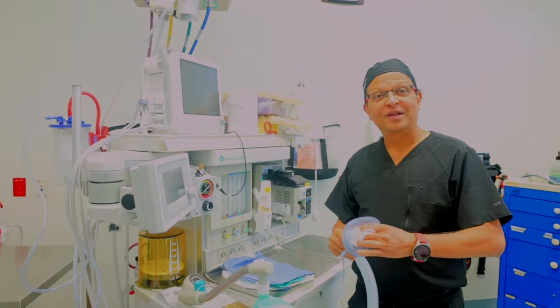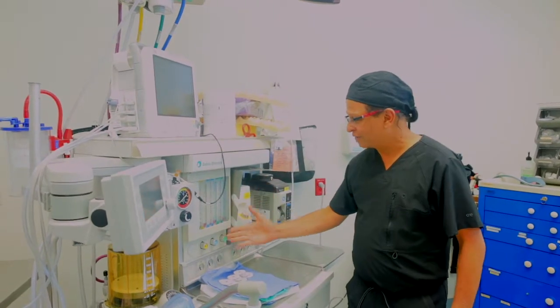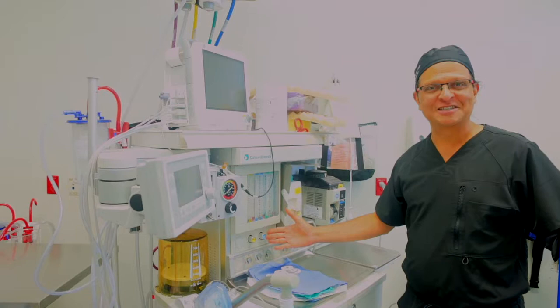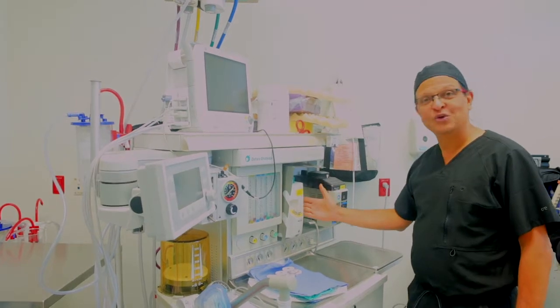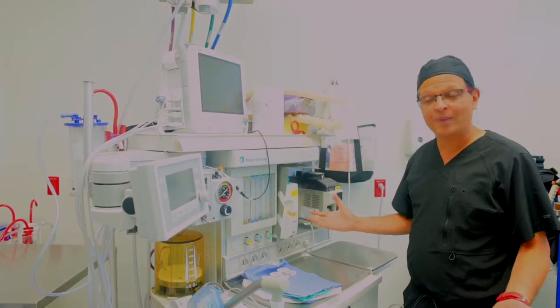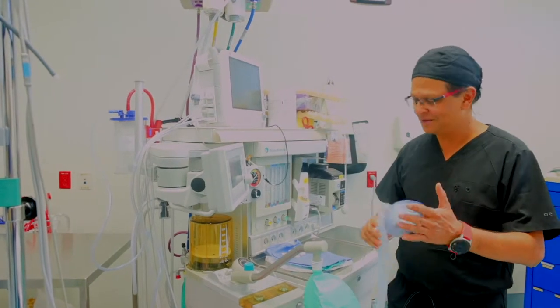And there are other anesthetic agents here. We have nitrous oxide, which is also known as a laughing gas, and we have even more powerful anesthetics called sevoflurane or desflurane. There are different kinds of very powerful anesthetics that are delivered through this breathing tube.